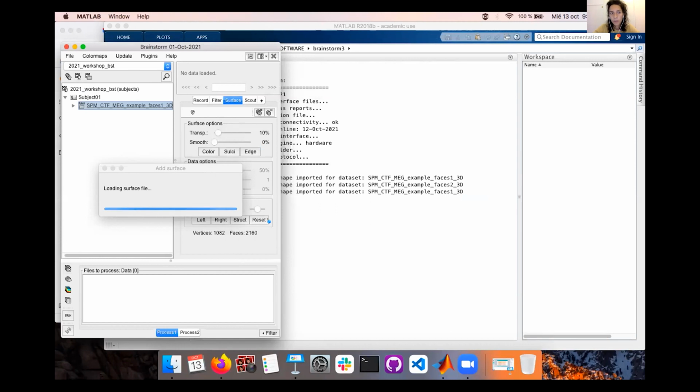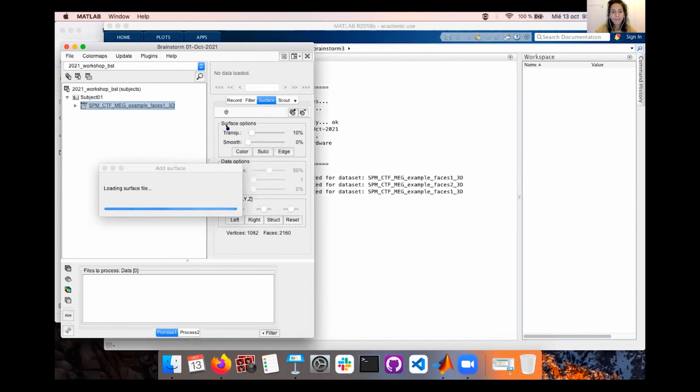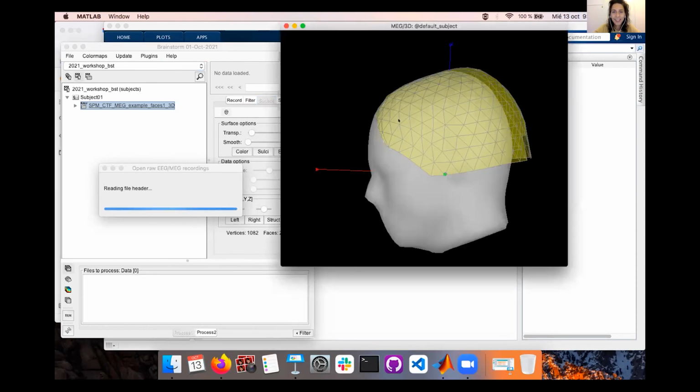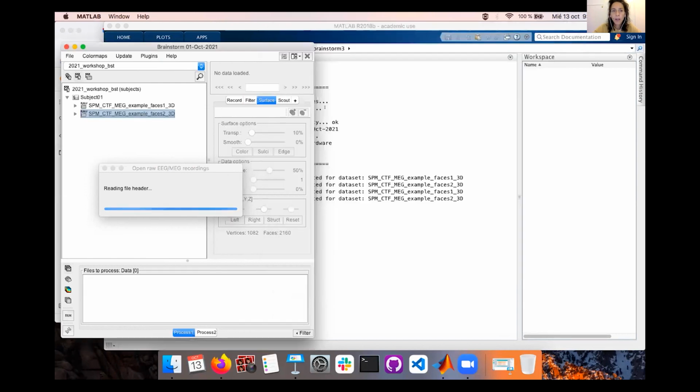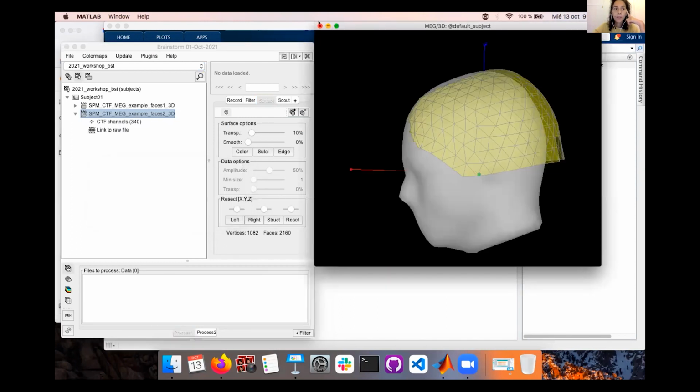And once you have them inside, we have one now. Sorry, my computer is a bit slow. Okay, because this is not the real MRI, maybe it doesn't fit very well. And also the alignment, you can check. This is very good. Brainstorm allows you to align very well and see how the cap is aligned with your data. So that's what you have there.